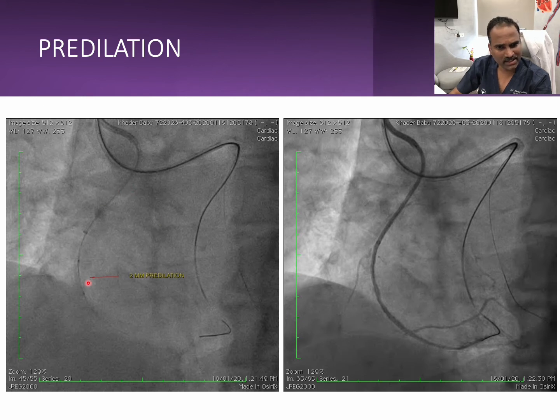that crossed the lesion. As the wire bias to the microcatheter is different from retrograde to antegrade, we can sometimes cross with the antegrade microcatheter despite the retrograde microcatheter not crossing. So that's what happened. Once the microcatheter went down, we exchanged to a support wire.